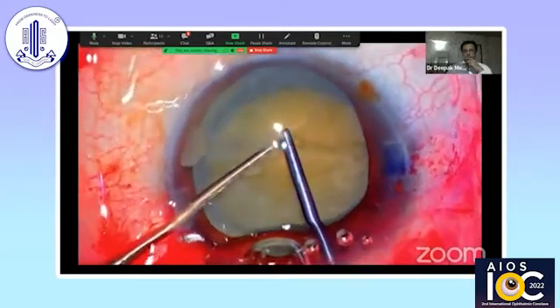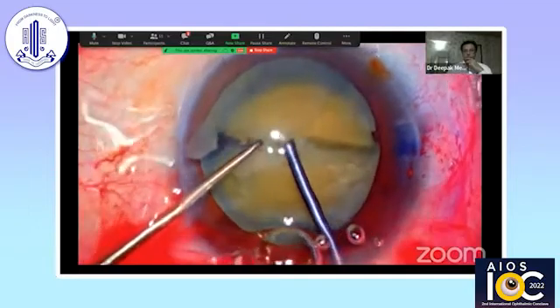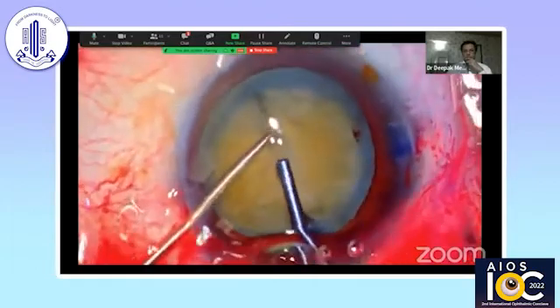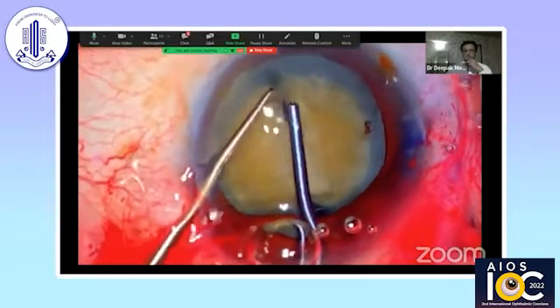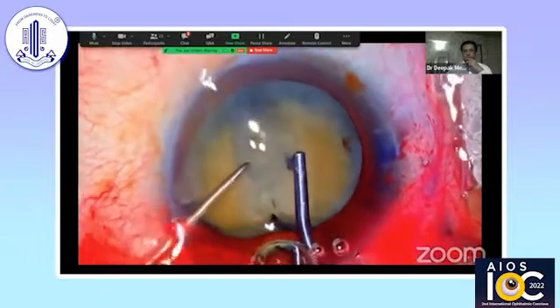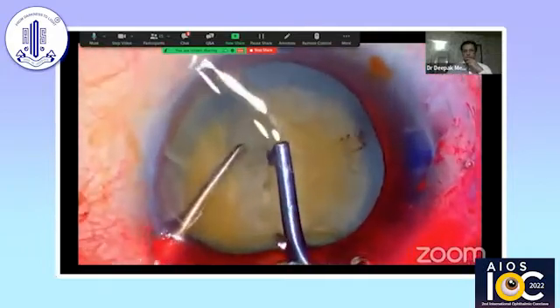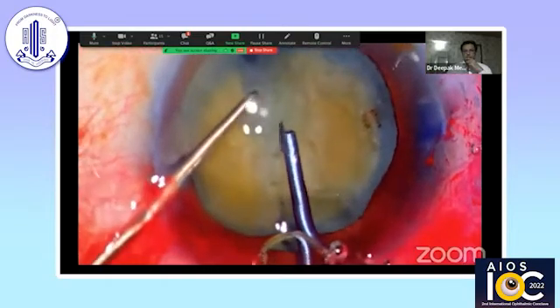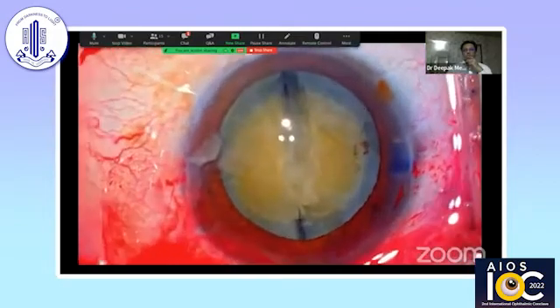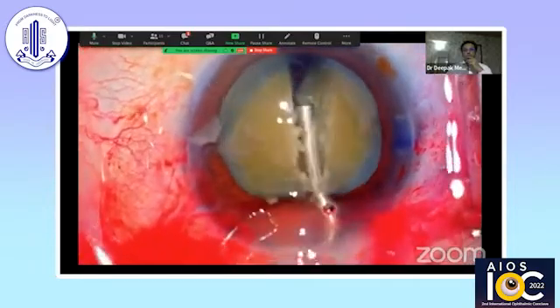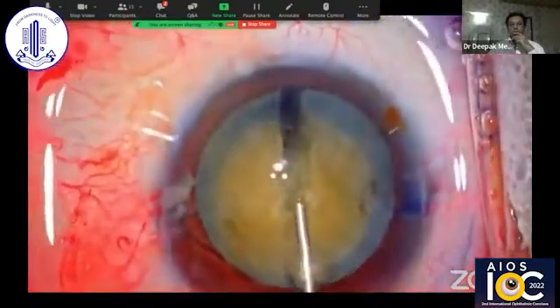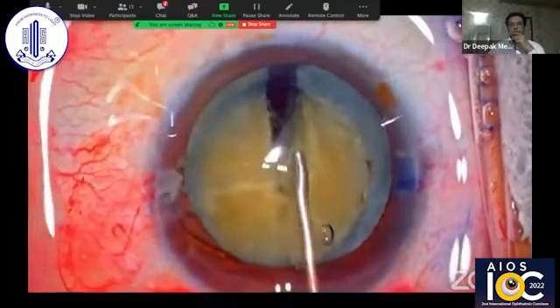Once we move the instruments toward each other, the crack is done, but I want to reconfirm whether the posterior plate is also broken. I rotate the nucleus a little bit and try to do lateral separation using the same two instruments, placing them inside the grooves and separating them laterally so that fine attachments near the posterior plate are released. In denser nuclei, the posterior plate could still be attached. I go in with viscoelastic and try to separate them using two instruments. OVD is introduced between the two hemi-nuclei inside the bag to help keep it well distended and maintain space.